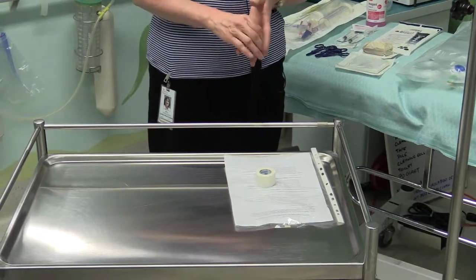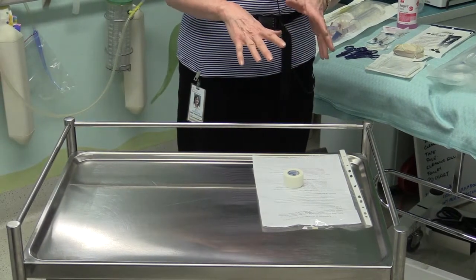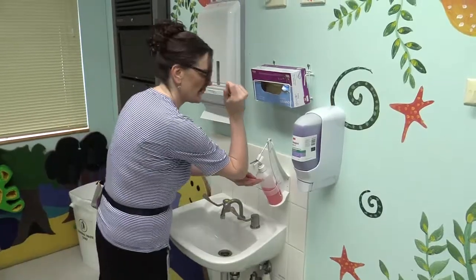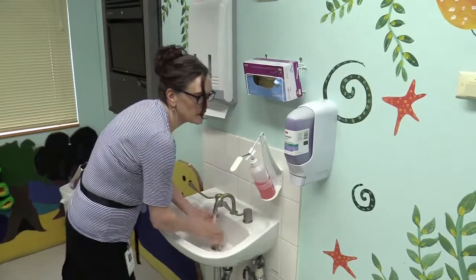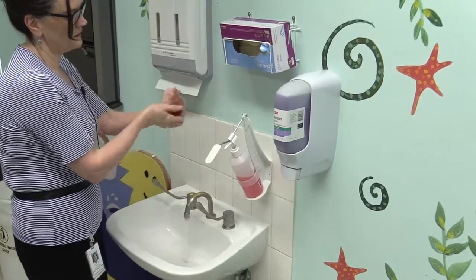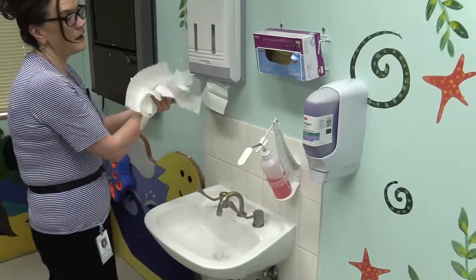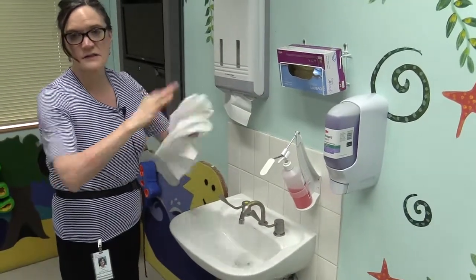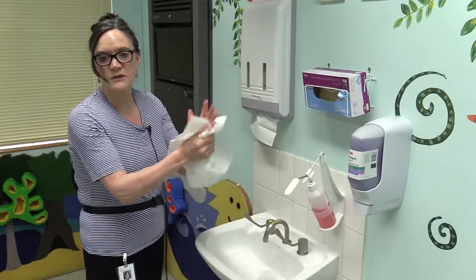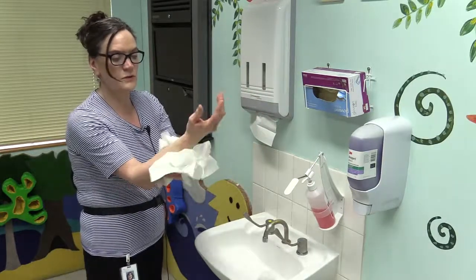Staff involved in setting up the peritoneal dialysis equipment should be following an aseptic technique, which includes hand washing. Okay, so I'm going to perform a simple hand wash just to clean my area and get my equipment organised. And can I just say that drying hands is just as important as washing hands, because if you leave your hands moist, bacteria can grow in the moist areas. That can be transferred to your equipment.